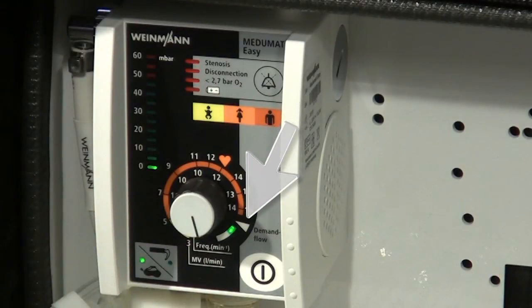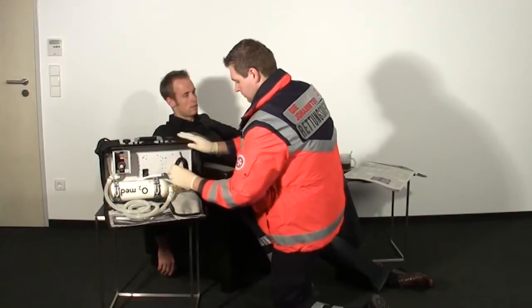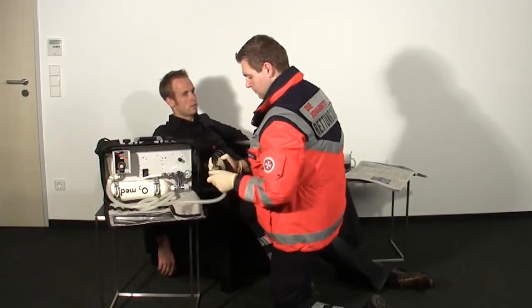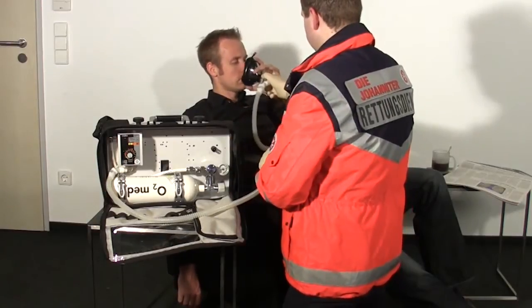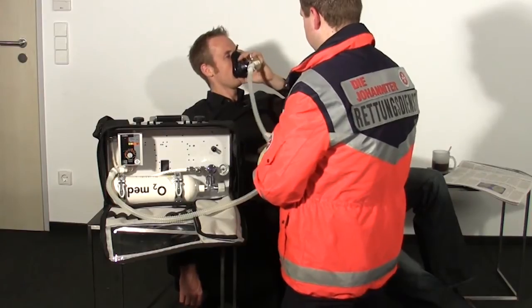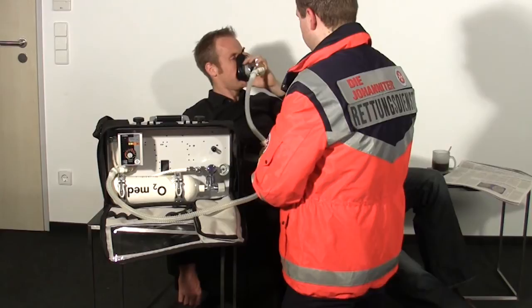You will notice some resistance in the knob at the white triangle. The green LED at the corresponding voice prompt — demand flow mode — will tell you that inhalation in demand flow mode has been activated. Connect the patient hose system on Mejumat Easy with the ventilation mask, and hand the mask to your patient. Instruct the patient to place the mask firmly on mouth and nose, and to breathe in and out evenly and peacefully.